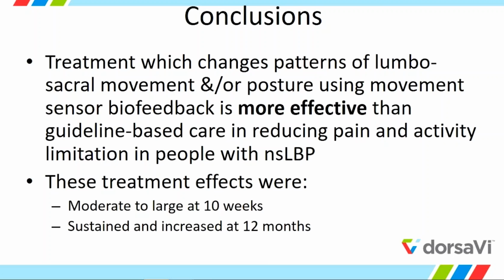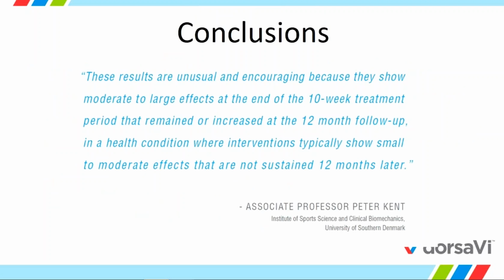I wanted to show this because I think it's important that you can see how you can integrate this into your treatment of your low back pain patients, because sometimes people are like, well, where do we start? Start with a live assessment, potentially monitoring, but also use monitoring with the biofeedback and the live training, and you can see the results that you will have. And then Peter Kent came out with the conclusion that the results are unusual and encouraging because they show moderate to large effects at the end of 10 weeks and then ongoing through 12 months.